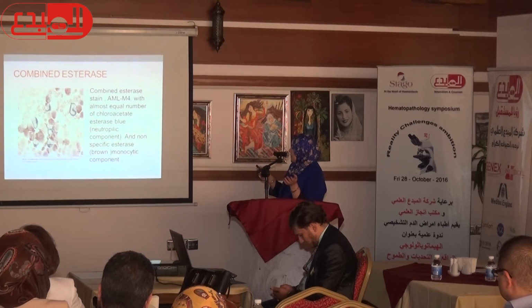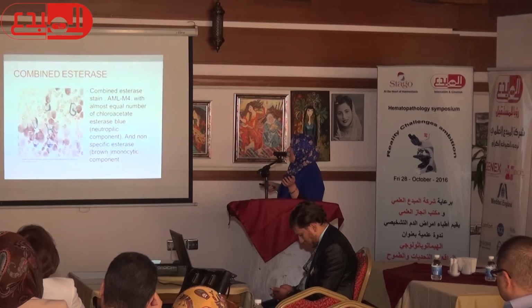So here you can see there is an equal component of alpha-naphthyl butyrate esterase with a brown color, and the specific esterase which shows blue. The original stain was red. When it's combined, it turns blue.